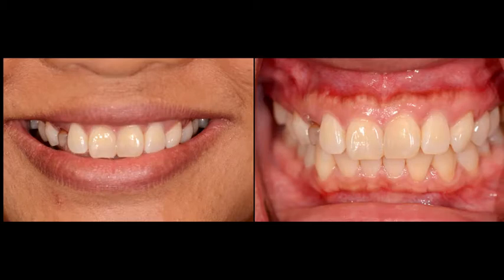This is a case that we performed several years ago as part of our mentor meeting, our live surgical demonstration seminars. This was a patient who presented with a congenitally missing canine, tooth number 6, specifically the upper right first canine, and she still had the deciduous primary canine in place.